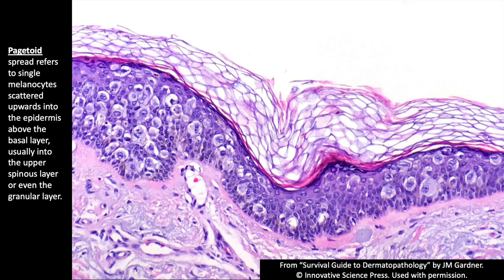This is classic pagetoid spread — very atypical melanocytes, even with some mitotic figures, spreading in a pagetoid pattern like buckshot into the epidermis, all the way up to the top. That's very characteristic.